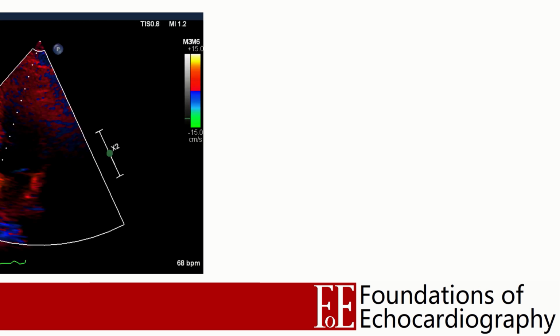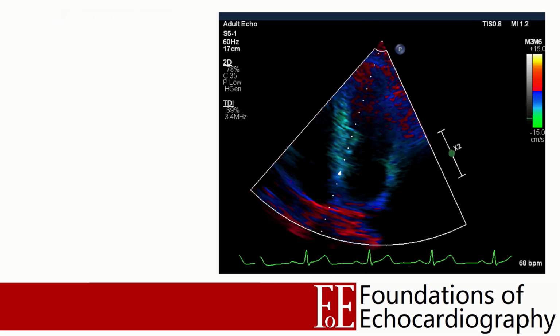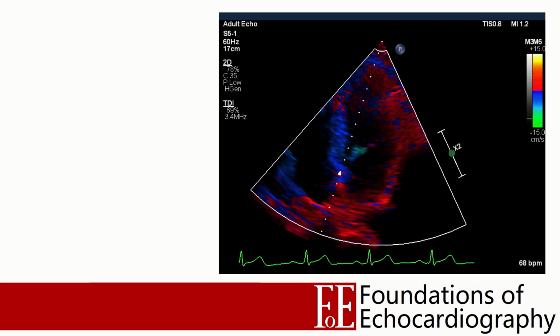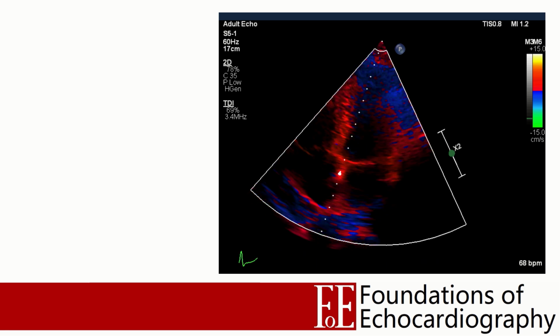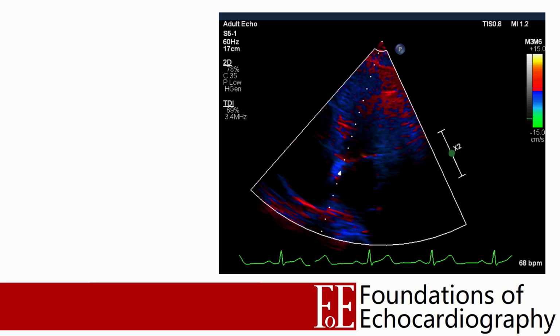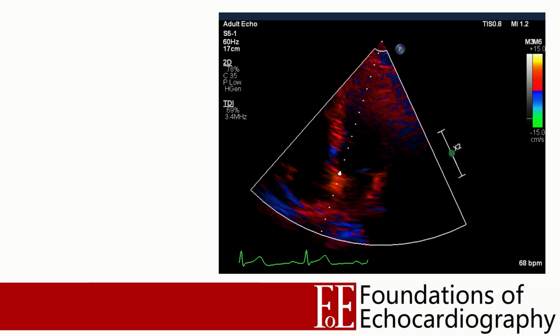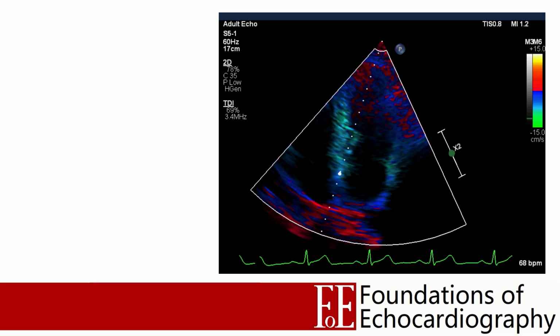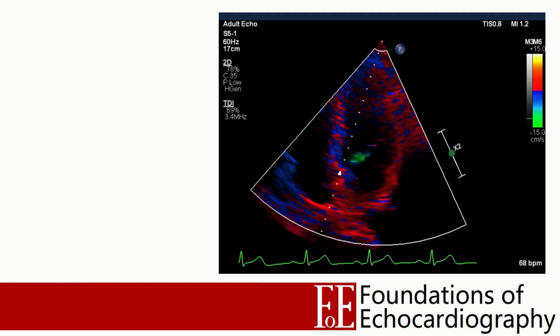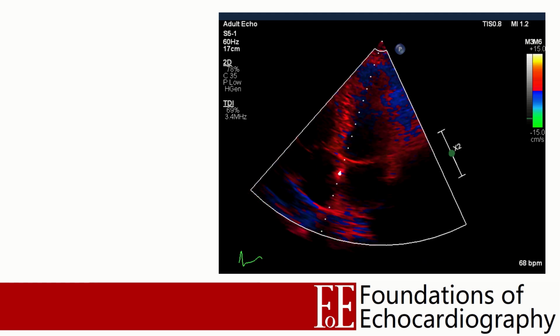Switching the ultrasound machine to tissue Doppler mode might produce a 2D image that looks a little like this. Here we have a standard apical 4-chamber view, but rather than displaying the heart using a grayscale, it's displayed as red when moving towards a probe and blue when moving away from a probe. We then place the sample volume over the LV wall at the point where the mitral valve leaflet inserts, and we're going to do this twice, both at the septal and lateral hinge points.